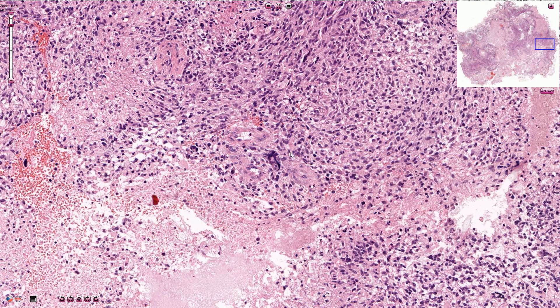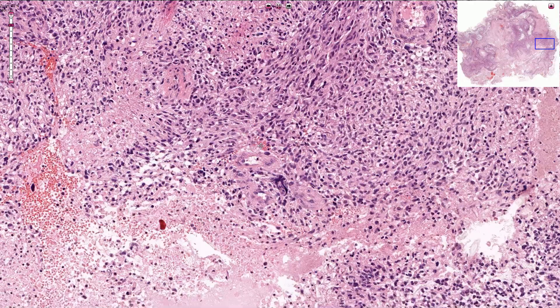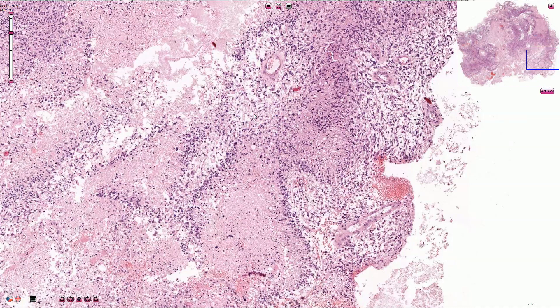Sometimes we can see microvascular proliferation or vascular thrombosis. Based on molecular studies, we can recognize the IDH wild type glioblastoma, which is much more common, and the IDH mutated variant. Specific glioblastoma variants include gliosarcoma, giant cell variant, or epithelioid variant.